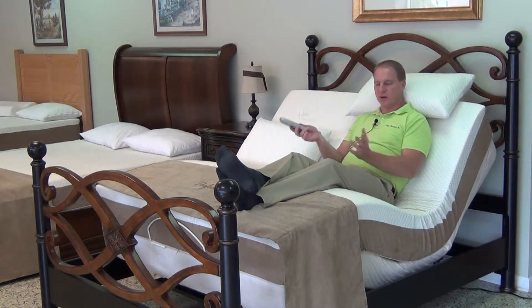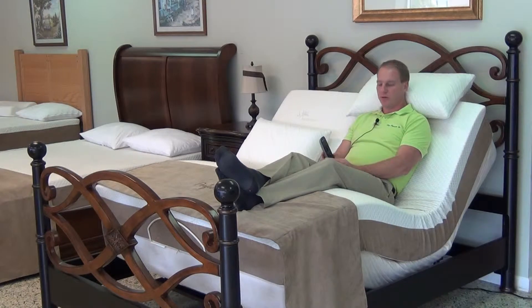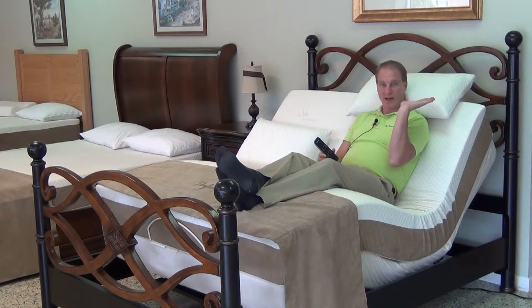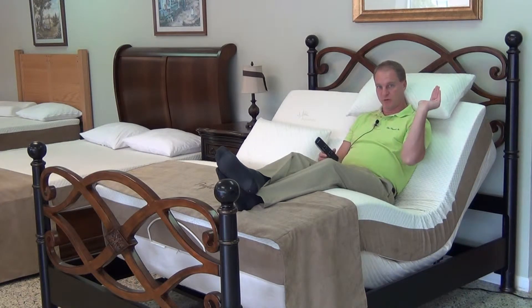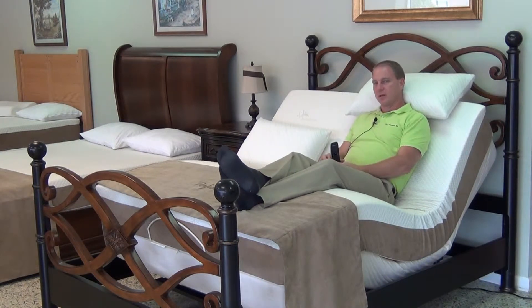One button flattens it out and it goes completely flat. I do sell another model — it's a lesser expensive model than this one. It is the ProMotion. The only thing it does is raise the head and the feet, no massage unit. This model is called a wall hugger model. Where you're raising the head up, the whole thing moves towards the back wall, which keeps you closer to your nightstand. The ProMotion model does not have that feature.